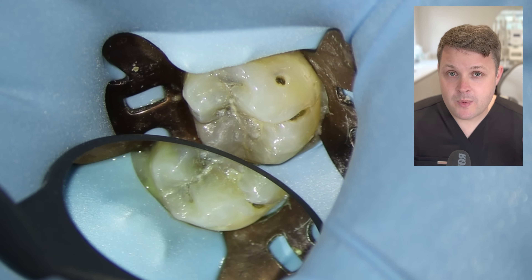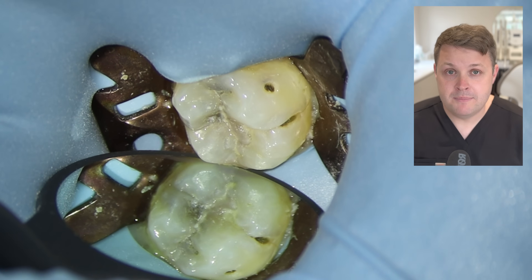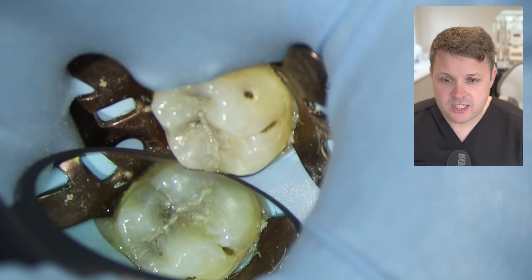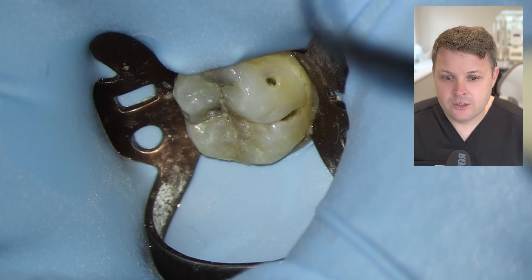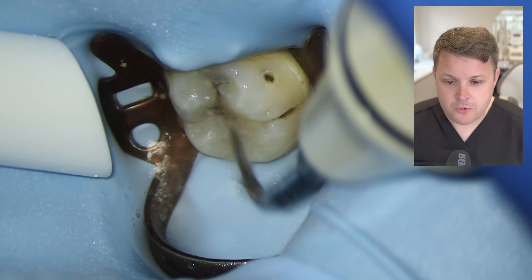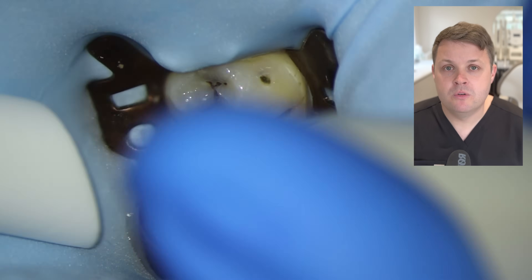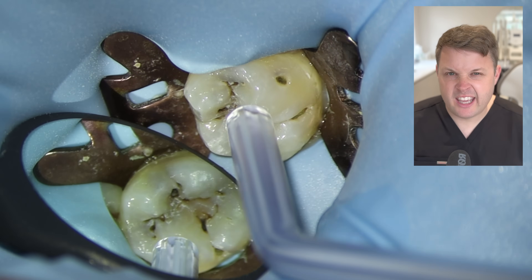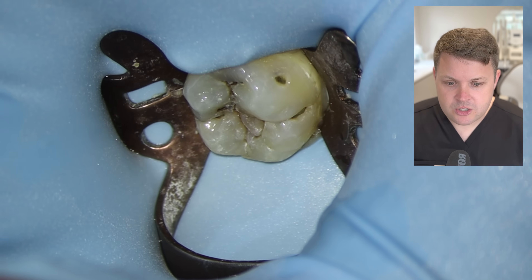Let's move over to the case. Straight away, we've rubber-dammed the tooth. The tooth doesn't have decay in the distal or mesial aspects, so I've done single tooth isolation here — it's just easier. The tooth looks a little unclean, so I'm going to use an ultrasonic tip to remove some plaque and calculus, give it a little cleanup. Now I can see where the decay is and we need to drill into this tooth.